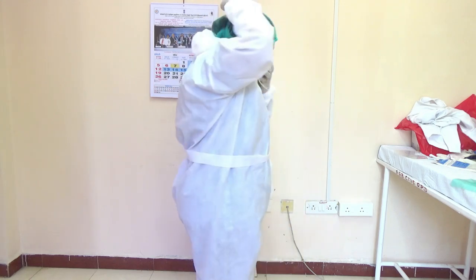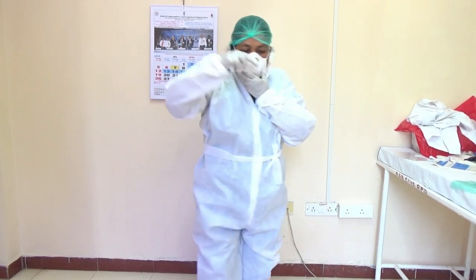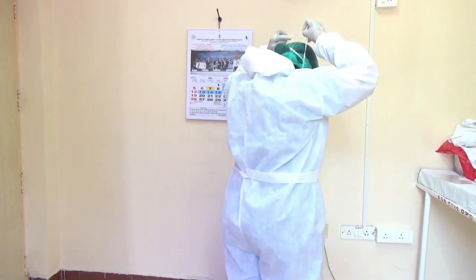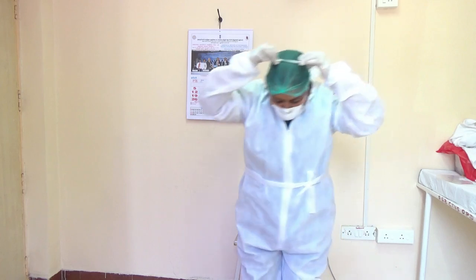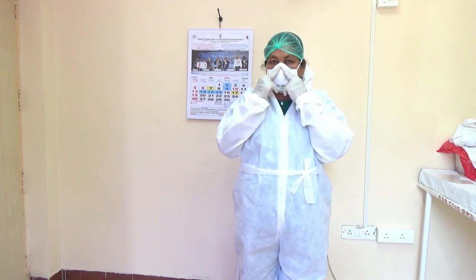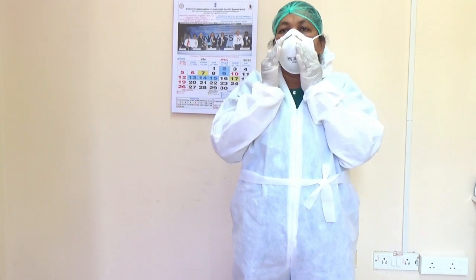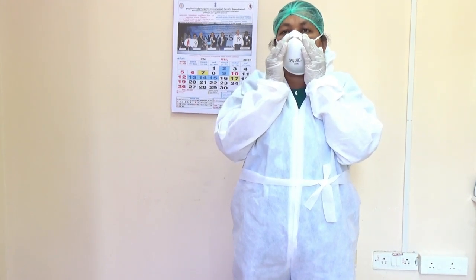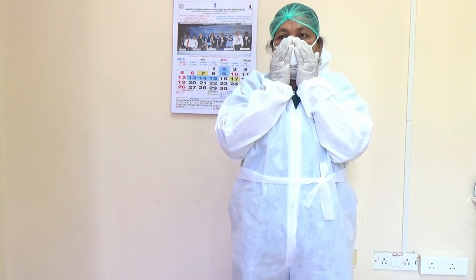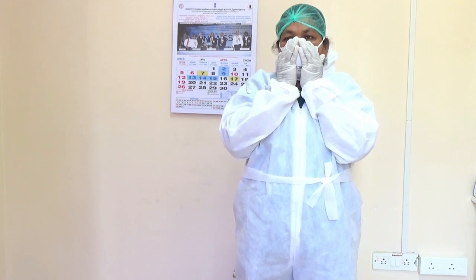Keep the nose strap over the occipital region, then pull the chin strap and bring it behind the ear and place it on the top of the head. Take two fingers and press slowly. Then do the fit check — keep your hand like this, inhale and the mask should draw inward; exhale and the mask should bulge outside. Then only it is functioning.